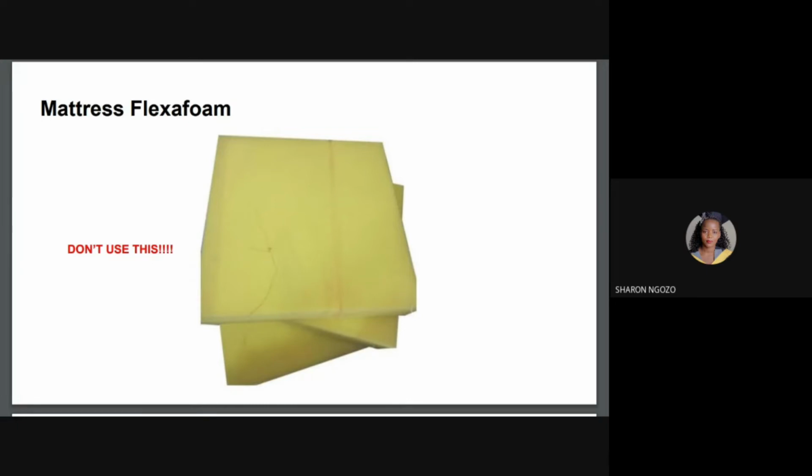Instead of using this, you can use a gauze bandage. You need to get a sizable length of gauze bandage and fold it 2 to 3 times. Make sure you fold the gauze to the same size as the filter you're replacing. Use that piece in place of the filter as you wait to purchase a new gross particle filter.